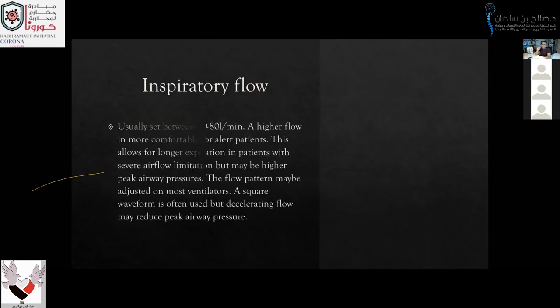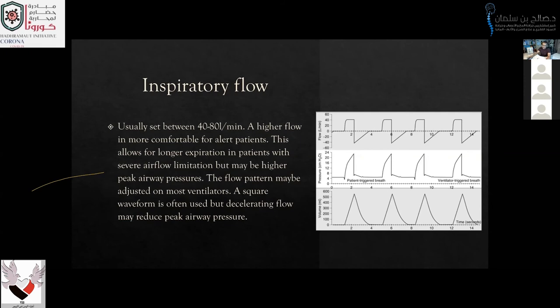Inspiratory flow usually is between 40 to 80 liters per minute. Higher flow is more comfortable for the alert patient. This allows for longer expiration in patients with severe airflow limitation, but may cause higher peak airway pressure. The flow pattern may be adjusted on most ventilators. A square waveform is often used, while decelerating flow reduces peak airway pressure.